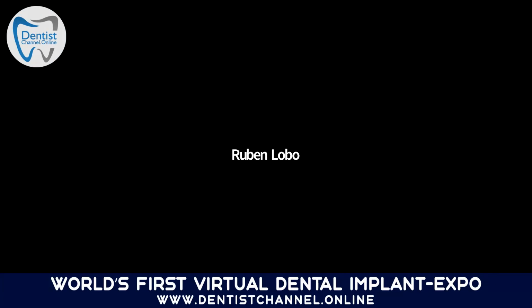Thank you, sir. Last question from the session. If one basal implant fails, do I have to remove all the other basal implants? No, not at all. No. So it's not a reason.